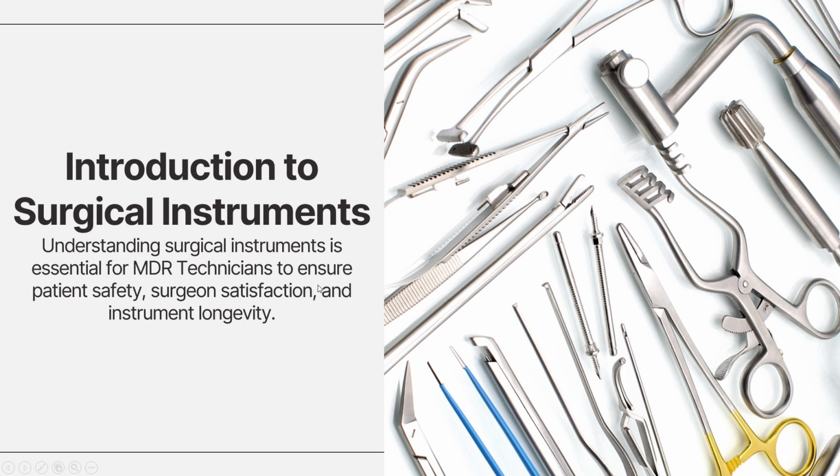So why is it important for MDR technicians to understand surgical instruments? Well, we have to be able to identify, assemble, and inspect instruments to ensure safety. We have to detect damage before it reaches patients, preventing harm to them. We have to know how to clean and sterilize instruments properly by knowing how to disassemble them and to care for them.